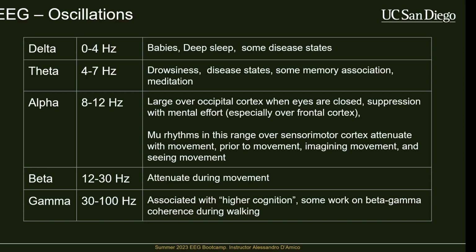I'm doing a very bad job drawing. They're actually a lot more sharp than that, but I can't really draw, so it's not great. They oscillate at the same primary frequency of alpha, but they have a sharp tail. They have this higher frequency component to them, and that's why they look like mus, which is why they're called mus.